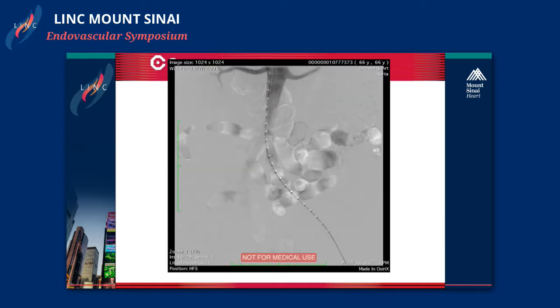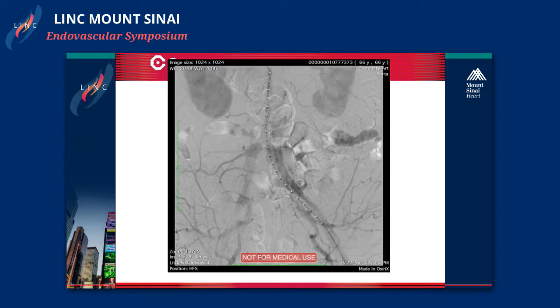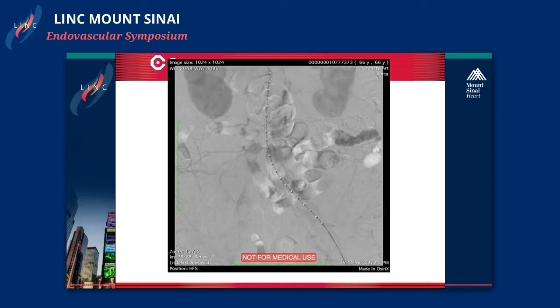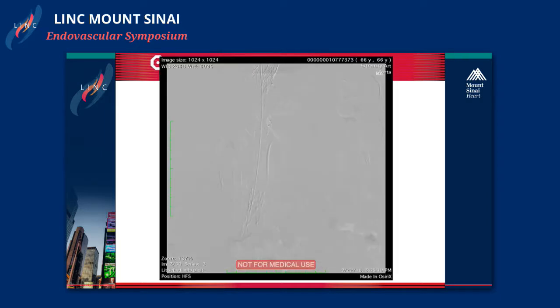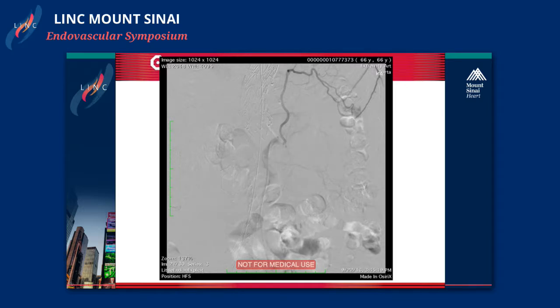So we had a multitude of reentry tears distally in the aortic bifurcation. And I like treating that with a nice Endologix device that sits really nicely on the aortic bifurcation and shuts all those little reentry tears down. So we started with that, got into the false lumen via a reentry tear in the left iliac artery, and then I start identifying all the outgoing vessels. So I want to individualize and embolize each one of those egress vessels, if you will.